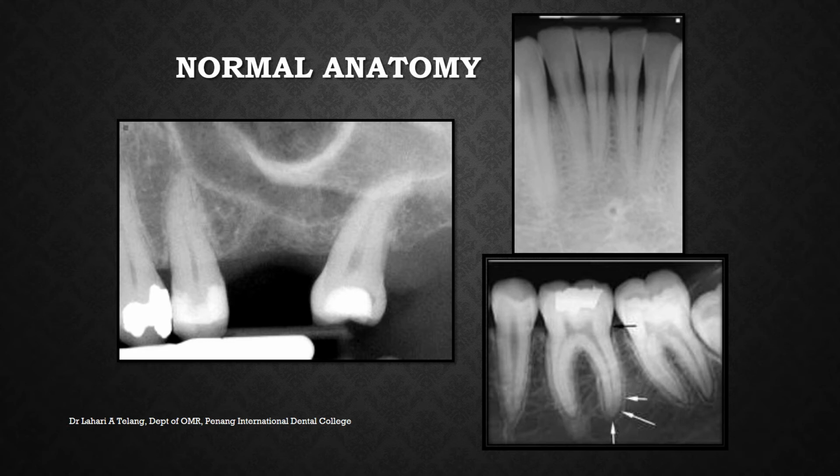And in this radiograph up here, you see the lingual foramen. So anatomy is something which needs to be kept in mind before you are analyzing any area, to understand which region you're looking at and what could be the normal anatomy that could superimpose over the region and aid you in diagnosis.